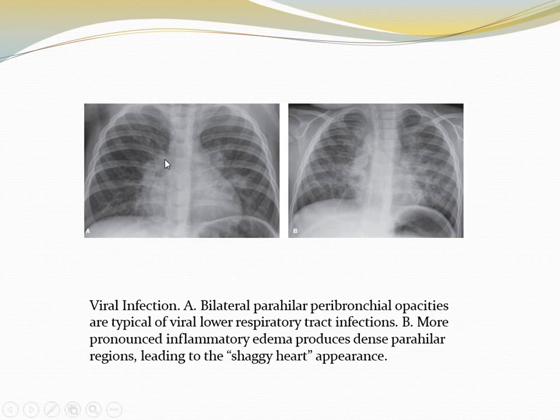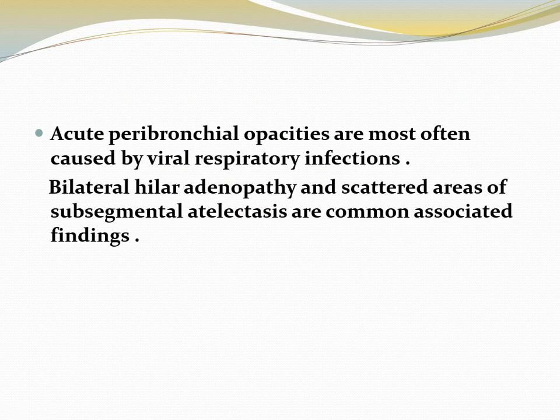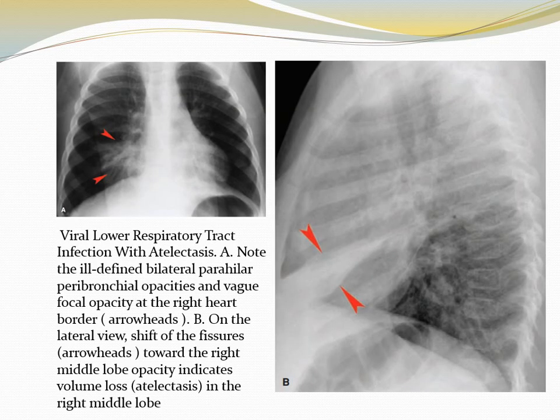Bilateral peribronchial opacity on PA view is typical of viral respiratory tract infection. More pronounced inflammatory edema produces a dense perihilar region leading to the shaggy heart appearance. Acute peribronchial opacities are most often caused by viral respiratory infections. Bilateral hilar adenopathy and scattered areas of subsegmental atelectasis are common associated findings. In this case it is associated with atelectasis, where the fissures are displaced, indicating atelectasis of the middle lobe.